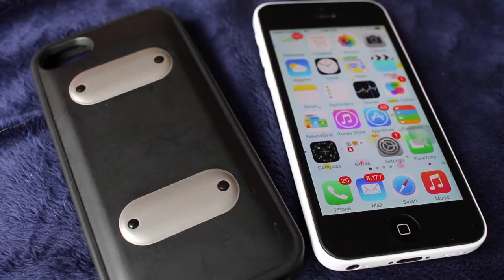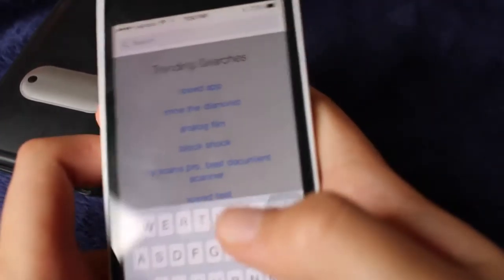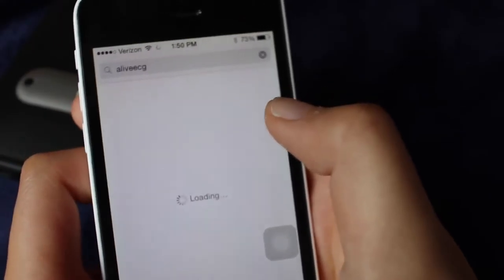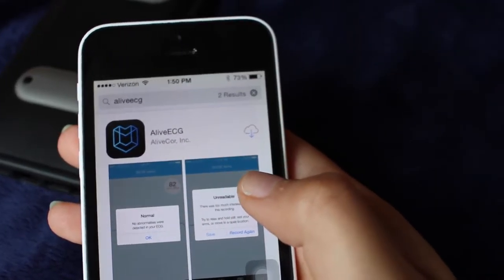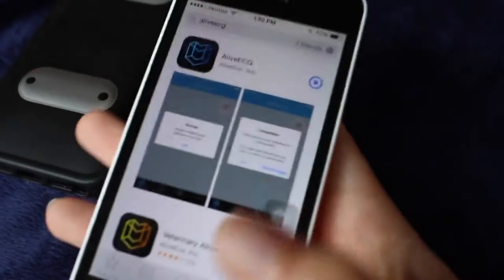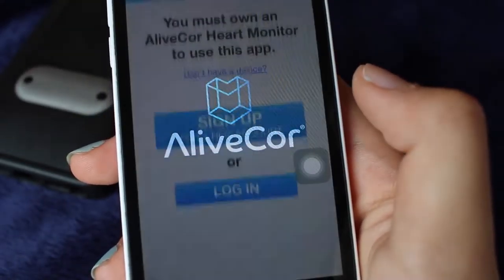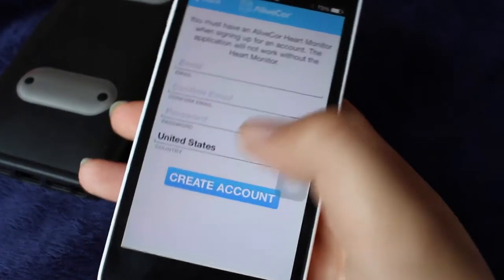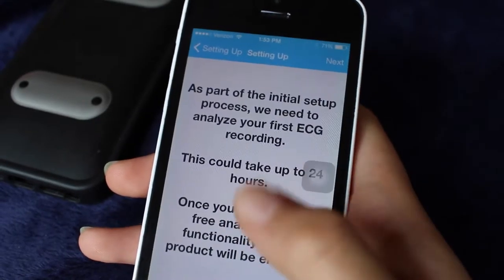How does a phone case measure all of that? A LiveCore Mobile ECG is powered by the LiveCore ECG app that runs on compatible smartphones or tablets. Go to your app store and download the ECG app to get started. Once you have downloaded the app, sign up for an account with your email. Then the app will analyze your first ECG recording, which could take up to 24 hours.